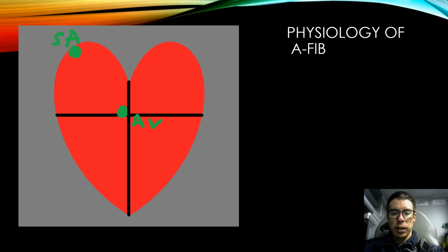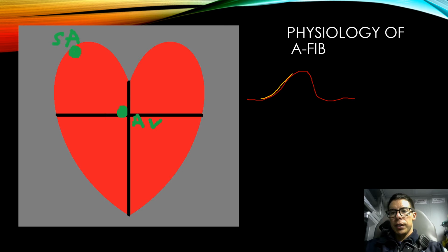So I'll draw it over to the right. If we've got a T wave, it'll be this first part right here where it's starting. That is called an absolute refractory period. And in absolute refractory, it cannot generate another impulse, it cannot depolarize again.